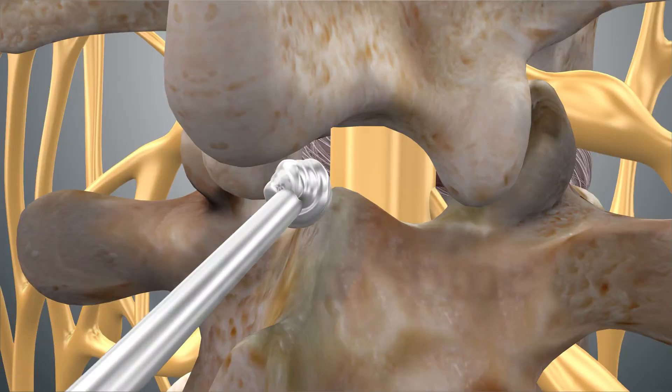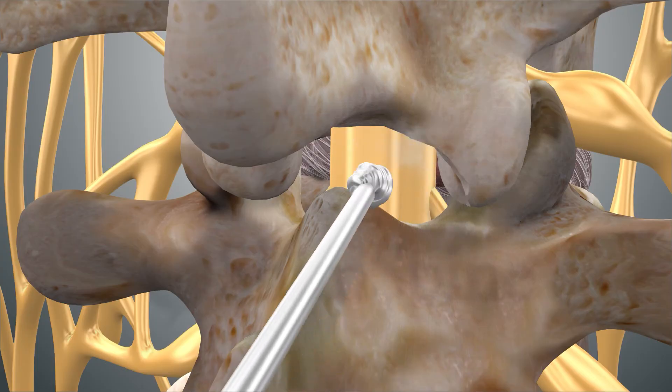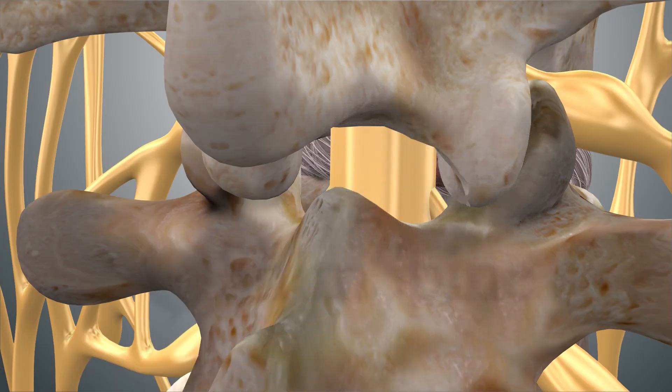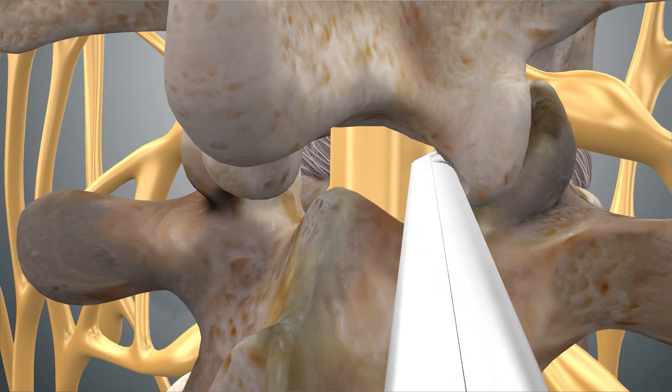Depending on the level, some of the bone will need to be removed to allow access. Tools including burrs, Kerrison punches, and curettes aid in the removing of the covering bone and ligament.